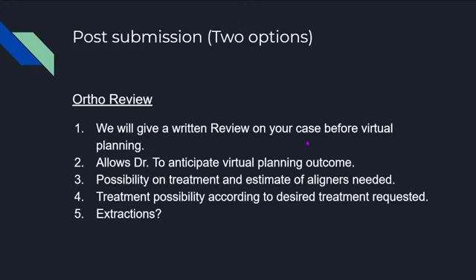Okay, so in some cases, for example if any of our doctors need to retake an impression, we will normally say that we will do an orthodontic review first, in between the time the doctor has to retake that impression. Then the next time the patient comes, the doctor has something to explain to the patient: look, this is the orthodontic review we have for you, this is what our orthodontist has to say. Then retake that impression, double check that it's good, and then we can do the virtual treatment plan after that. So an orthodontic review is good, a review without impressions or intra-oral scans.